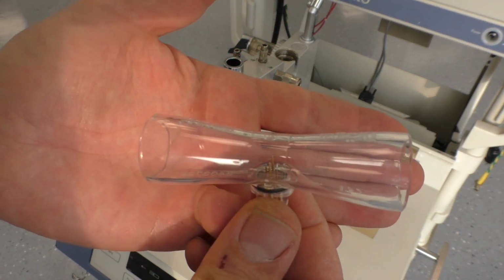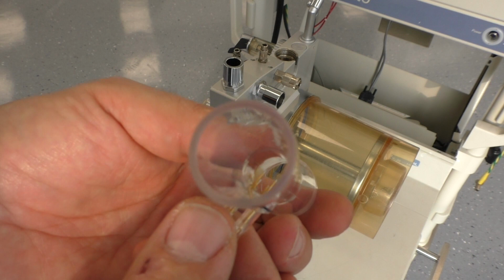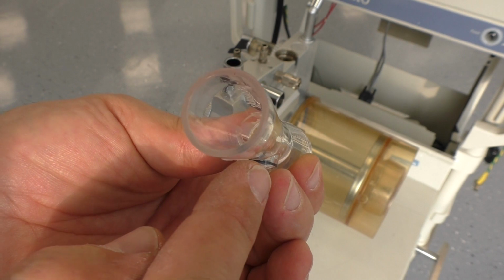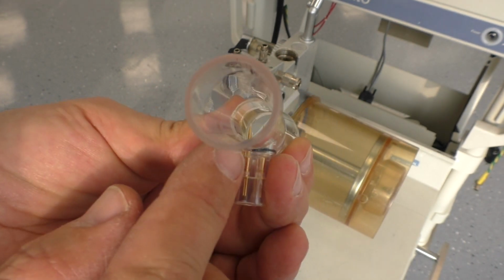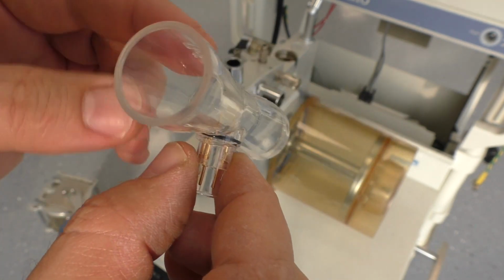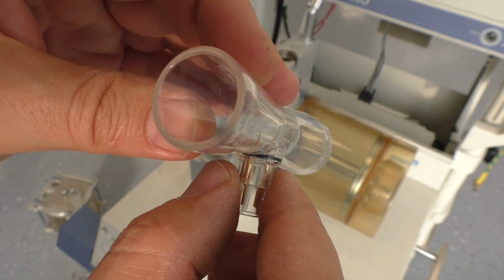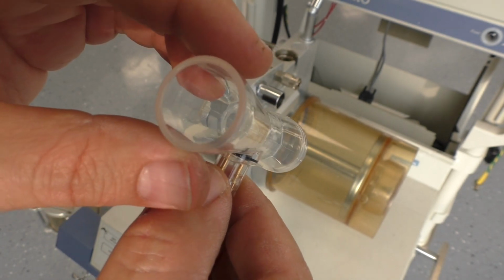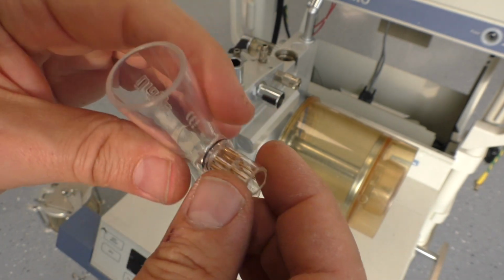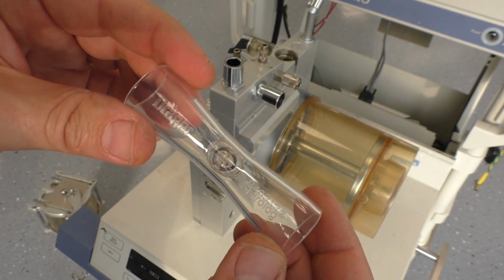4 golden needles here. There are 2 very, very fine wires. One goes from the leftmost needle to the rightmost needle, and the other goes diagonally from the one short needle to the other short needle. I don't know if they heat it up electrically and then measure the cooling of the wire, or I don't know what exactly they do. Maybe we can find out a little bit later.